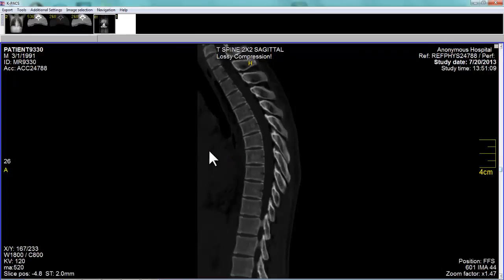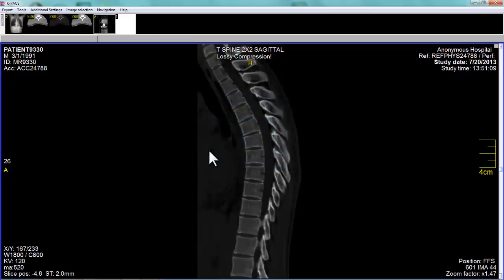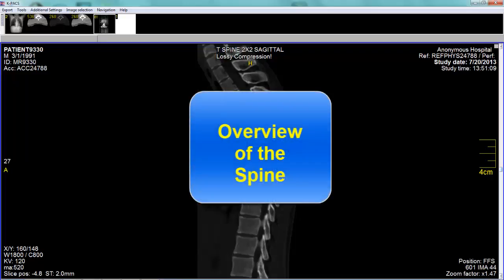Back pain can be caused by any number of things. For simplicity, I'm going to divide it arbitrarily into three categories: trauma, infection, and tumor. I'll say a few key points for each type of cause of back pain. But before we discuss that, let's just do the general overview of the spine.